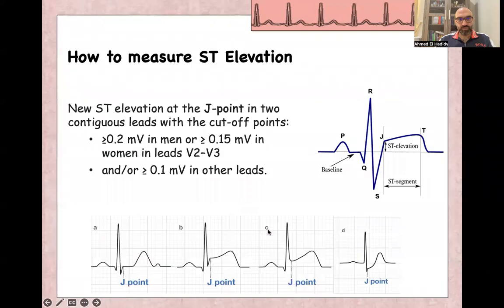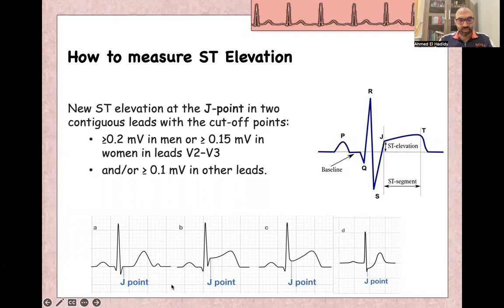ST elevation is measured from the J-point, which is the junction between the ST segment and the QRS complex. To classify as ST elevation, we must have more than 0.2 millivolts in men, or 0.15 millivolts in women in leads V2 and V3, or more than 0.1 millivolts in the other leads. This is a normal ST segment; this shows an elevated ST segment of more than two small squares, meaning more than 0.2 millivolts. This is the J-point with ST depression.